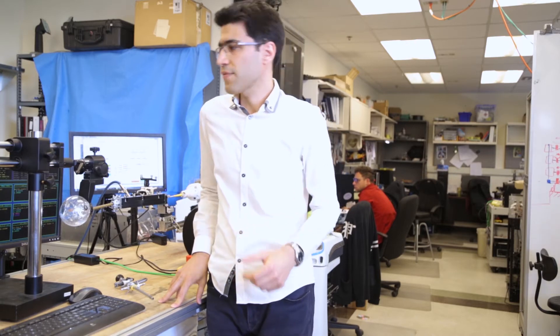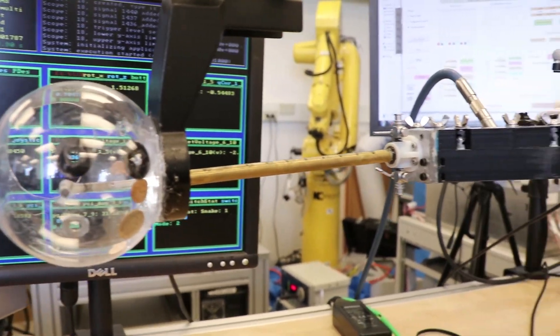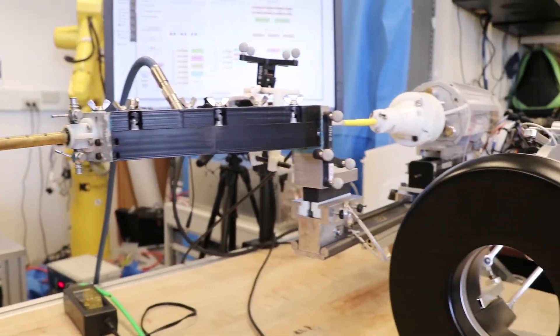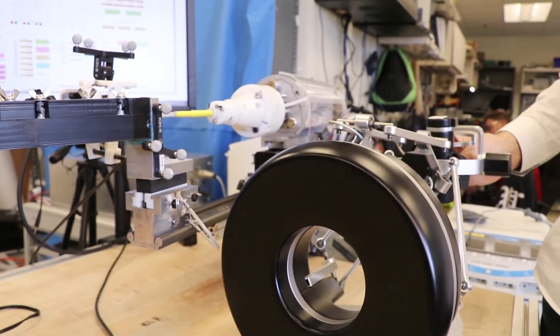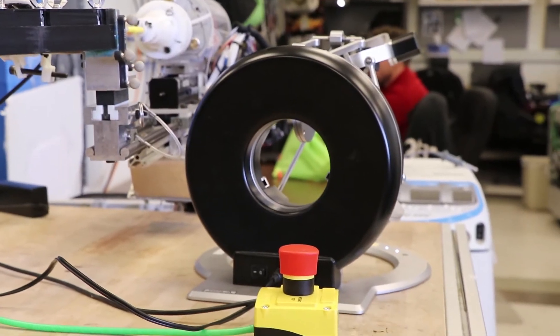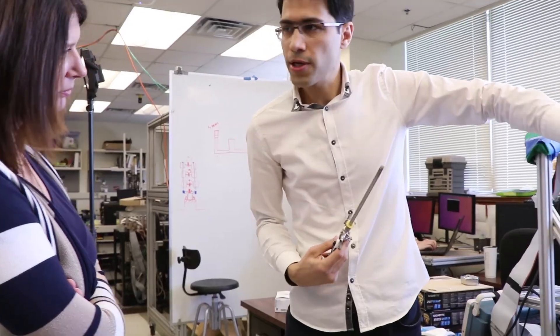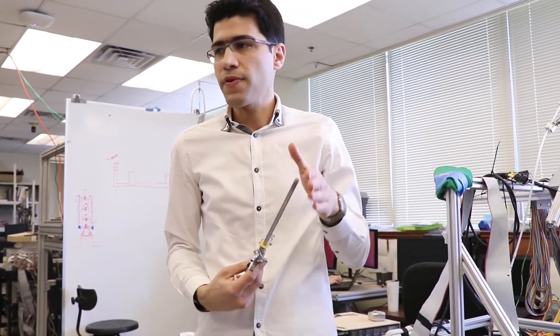These challenges motivated us to design a robotic device that we call Turbot. It has a snake-like device at the distal end which provides even more dexterity than human hands. The surgeon can steer this robot with a haptic device, essentially an advanced joystick. Using this robot, the surgeon can reach the entire urinary bladder and perform resections that are more accurate than manual resections in a safer way.